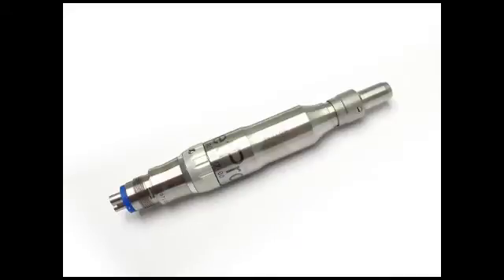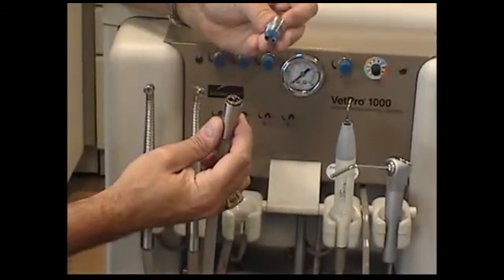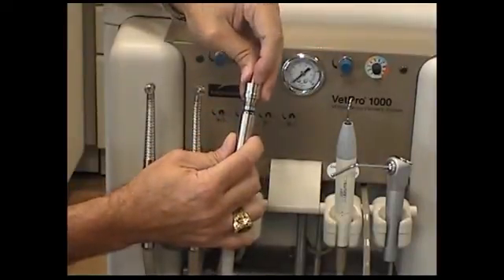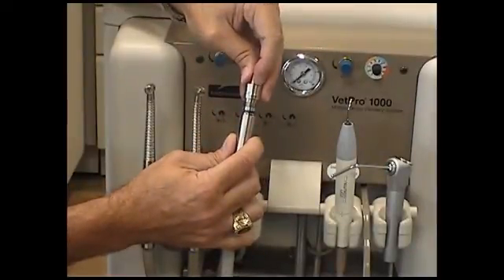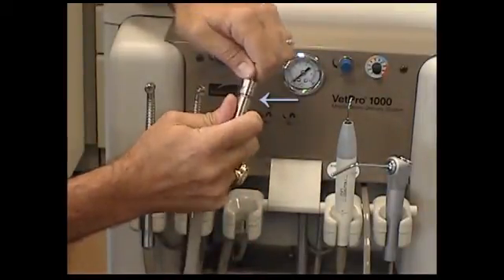Next is the low-speed handpiece, typically used for polishing your patient's teeth. Separate the swivel adapter from the rest of the handpiece by pulling back the quick-connect collar as shown. Install the swivel adapter on the hose first. Hold the black O-ring on one end of the piece and insert the other end onto the hose. Screw it on tightly using the silver sleeve on the hose. You will see a slight gap when you have it installed.